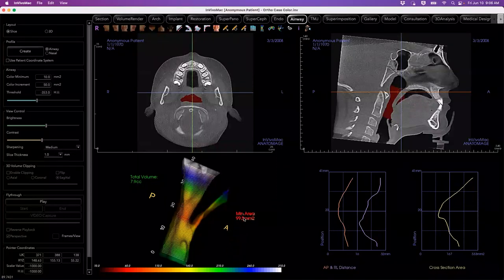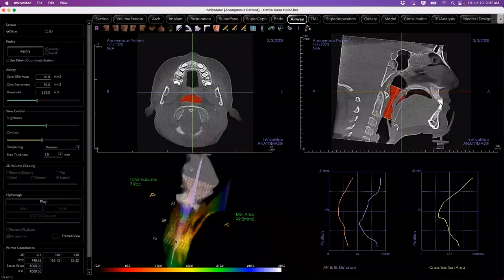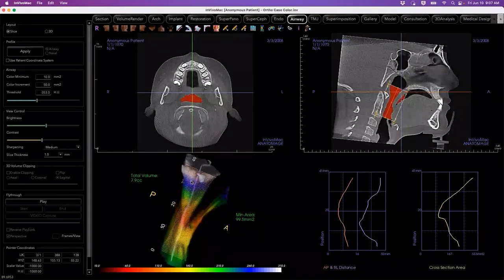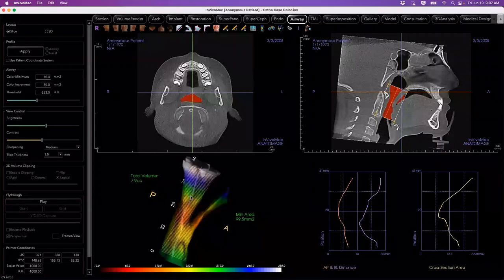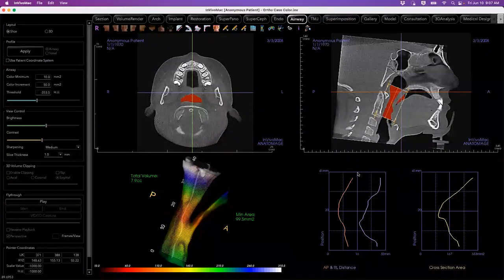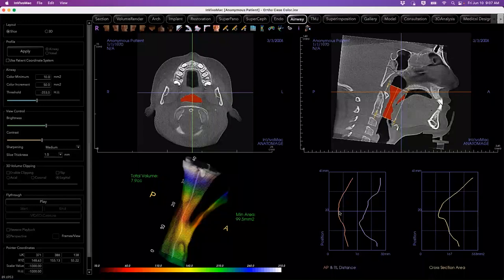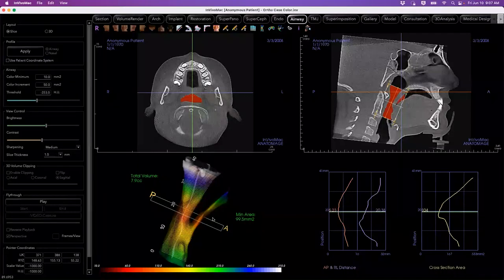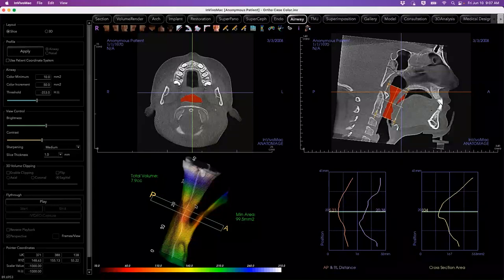The software guides us through airway isolation by asking us to place a couple of points in the direction of airflow — typically on the soft palate going in the direction of airflow, ending somewhere along the epiglottis, then right-clicking to finalize the isolation. At the bottom, our screen adjusts and populates additional views: a 3D rendering giving us total volume as well as minimum area, and graphical data represented from that model. If we click anywhere on our graph — which displays anterior-posterior as well as right and left distance measurements in our cross-sectional area — it will display the approximate location of those values on our 3D rendering.